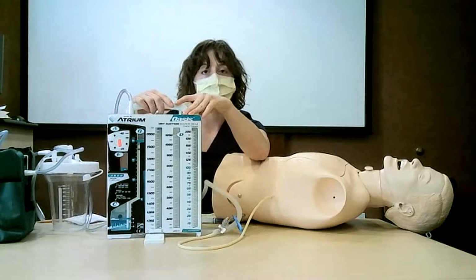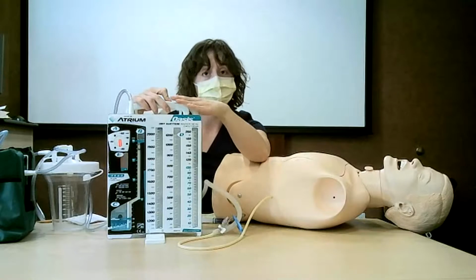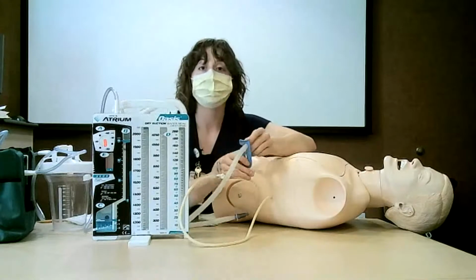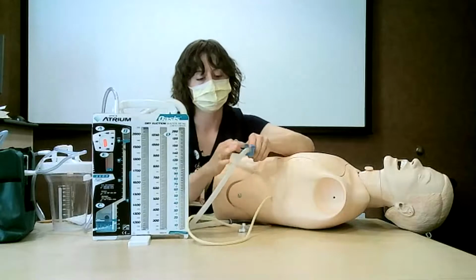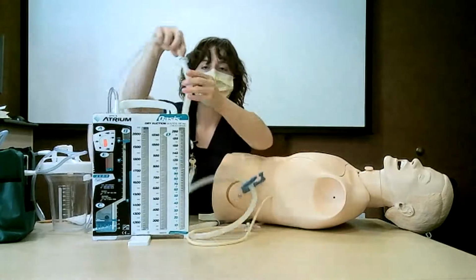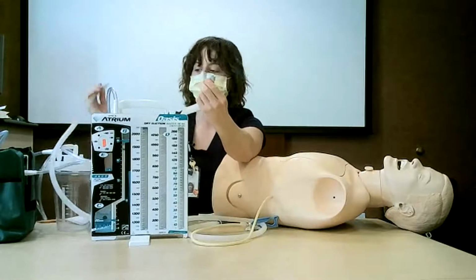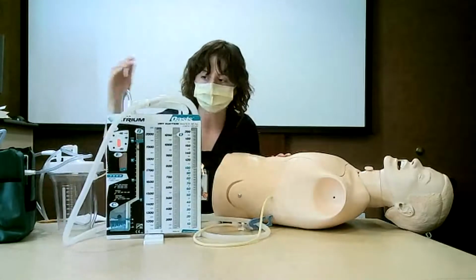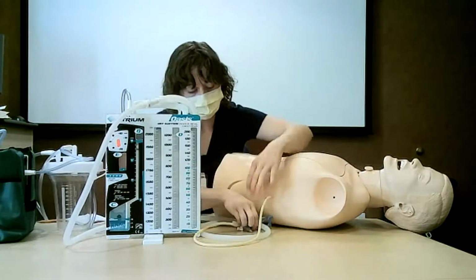If your atrium becomes full at any point, we can replace it. The most important thing to make sure you do when you're replacing an atrium is clamp the chest tube. If the chest tube is not clamped when you change it over, you risk a pneumothorax for the patient. So obtain your new atrium and clamp the chest tube with the blue clamp here. And this port here will just come off and you'll apply the new atrium like this. You'll do your safety checks as we talked about previously, making sure that the suction is set up correctly and all of that.